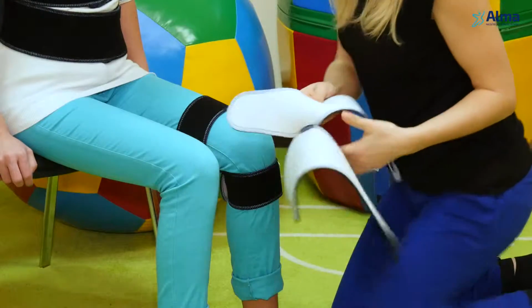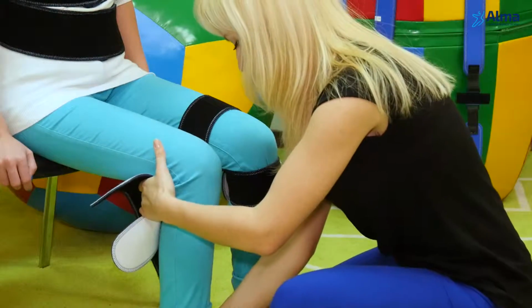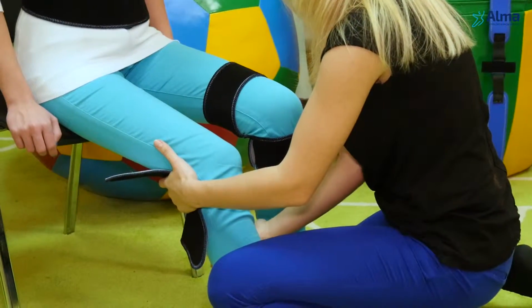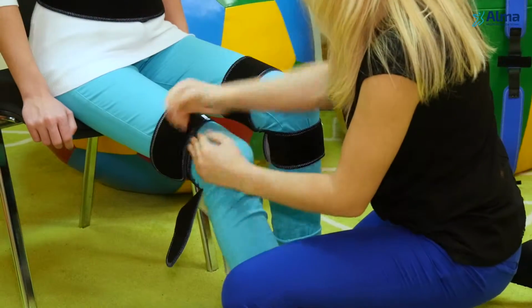First, put on integrated bandage for thigh and calf. Leg shall be half bent in the knee. Bandages shall be located as follows. Joint shall be located in a knee hollow and fastener on the lateral knee surface, with front area closing.